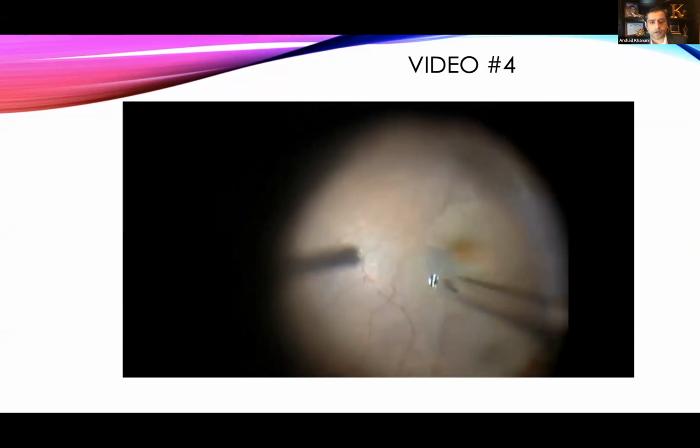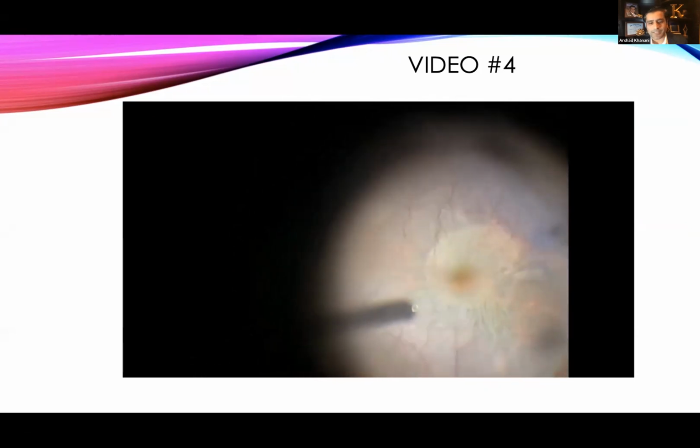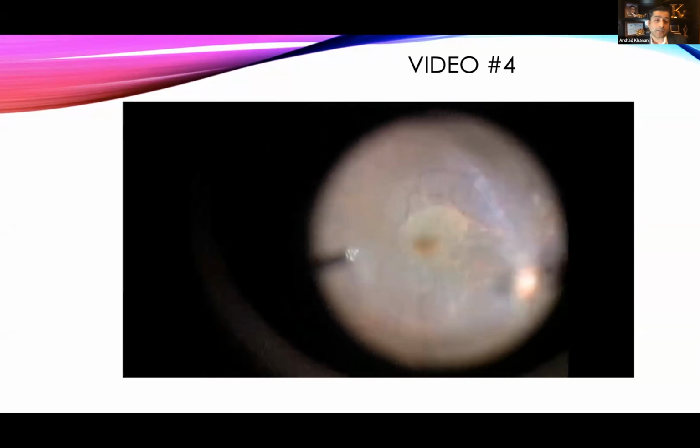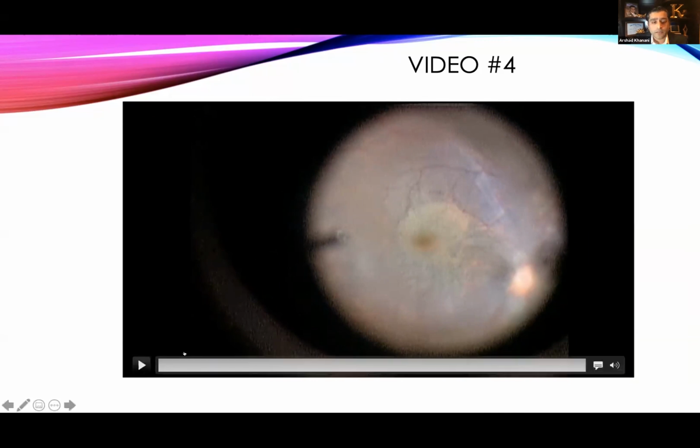Any comments from you, Carl? I know you would have done better and quicker than me because you're a super surgeon, but the negative staining, I think it's a really good thing. Some people don't like it. I've seen people say, well, it's not staining well, look for that ERM, look for the negative staining. And Mitchell made that point earlier that a broad area of staining is much better, because then you can see the negative staining much more nicely. So I really love it for my ERM cases.